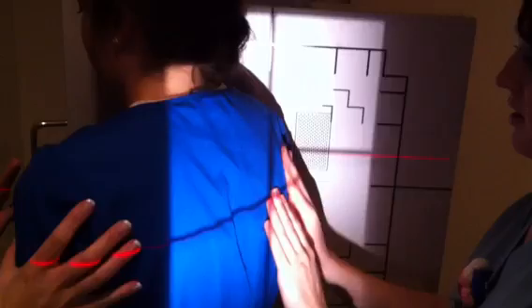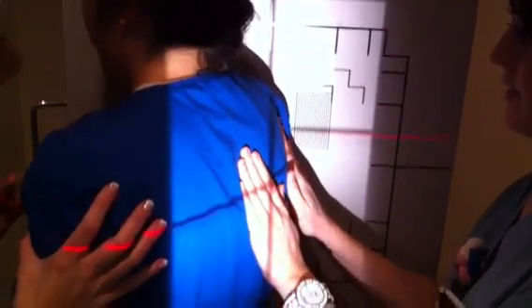Perpendicular. Palpate the scapula — where's the edge of your scapula? Can you feel it? Maybe not. You're muscly. You're not big, you're muscle, which is good. There it is. I'm trying to pop that out. So here's the flat surface, right there. And it should be perpendicular to your central ray. She's about 45 degrees. So what you're doing is you're skimming — going in right at the shoulder blade. You're skimming it, and you're perpendicular.